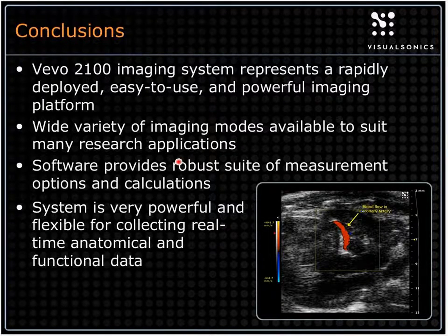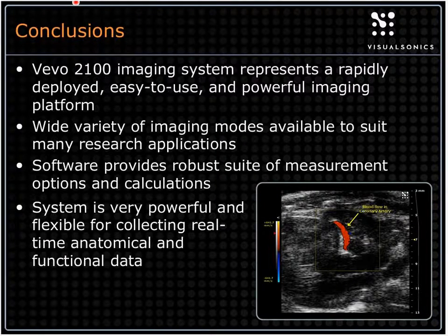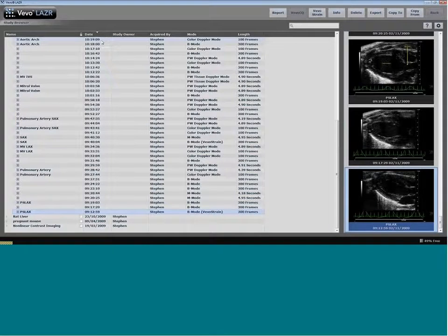That concludes the PowerPoint portion. We had a very quick, basic overview of the 2100, covering B-mode, color Doppler, pulse wave Doppler, VivoStrain, and some image settings. I'll move into the Vivo software right now. This is the Vivo 2100 software for post-analysis.